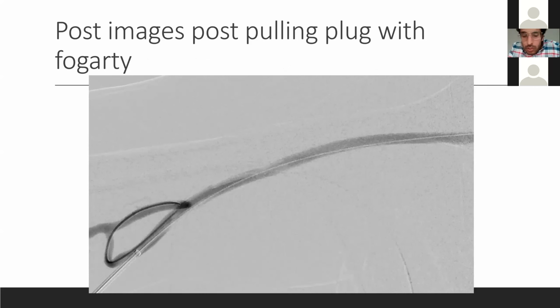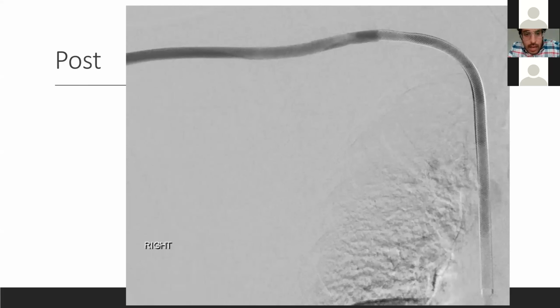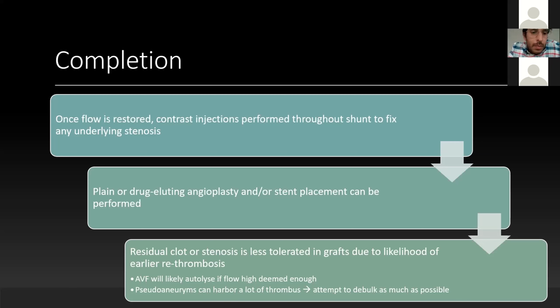And then usually there's some downstream stenosis or something that you need to fix here with balloon or stent. With HERO, declots tend to be more straightforward, with fewer issues that you need to fix, but this is what you want to see, a patent access. Once the flow is restored, contrast injections are performed throughout the shunt to fix the underlying stenosis. You could do plain or drug-eluting angioplasty with or without stent placement. So you have a bunch of different options available to you. Some of this is a little bit controversial with the DEB, in addition to using stents, but those are your options.